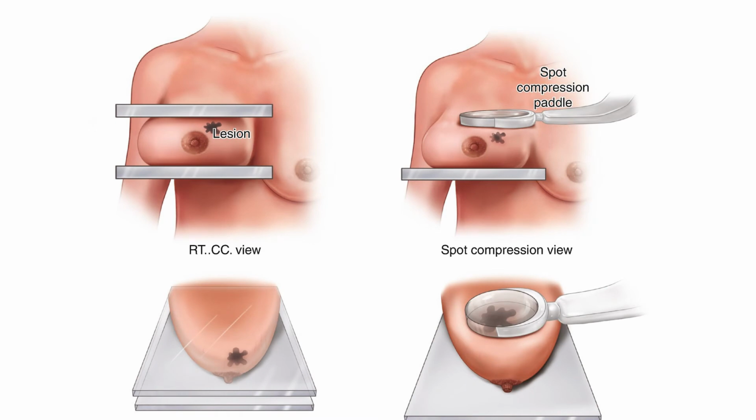For many years, due to very dense breasts, I've done the very isolated imaging, and also have done ultrasounds to understand the dense spots that I have. My experiences with the spot compressions have been pretty uncomfortable. They end up being a lot of compression, a lot of pain. It requires you to hold your breath and stand in a very unique position so that they can get the proper image. I understand why it's needed, but it's not usually a very pleasant experience.